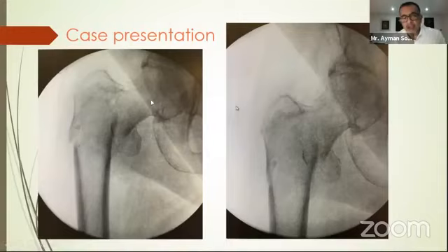We put in traction, it's gone into varus. I'm not going to leave the fracture like that. And we can see that this is a trochanteric fracture with extension to the basal neck. So this is a fracture that is difficult. I started with this position in varus. I was not happy with it, so I increased the traction. I ended up with some distraction in the femoral neck.